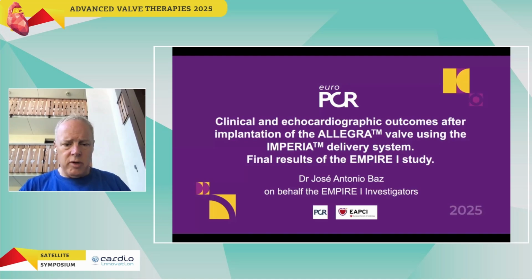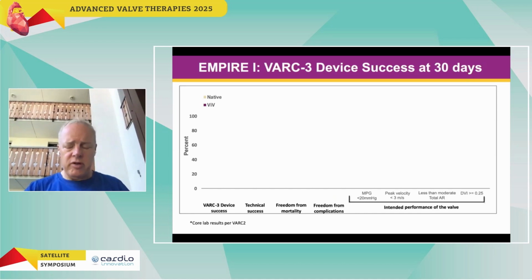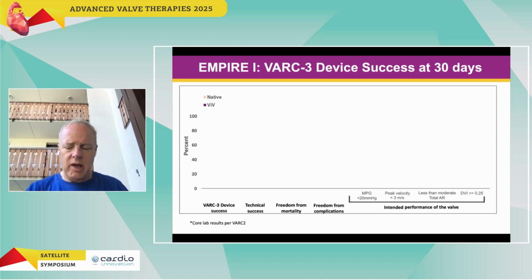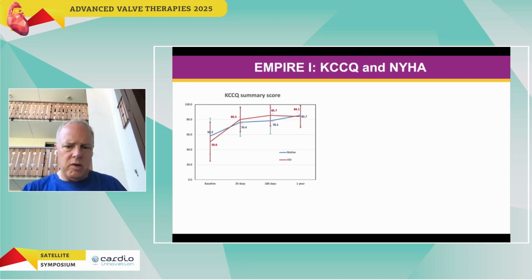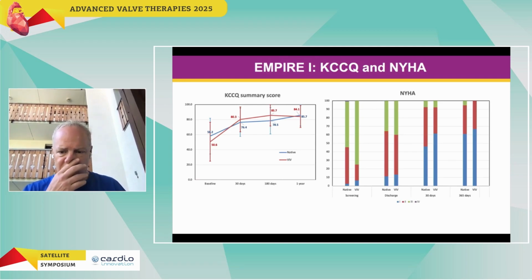We have just reported the 1-year results at EuroPCR, again by Dr. Bath. I'll just briefly mention these. This time we reported VARC3 device success at 30 days to bring it into line with the more contemporary VARC3 definitions. So VARC3 device success in the natives was 87.3%, 100% in the valve-in-valves. Big improvements at 30 days were maintained out to 1 year, and pretty well in keeping with the data from the SMART trial. And NYHA also showed dramatic improvements, even further improvements from 30 days to 1 year.